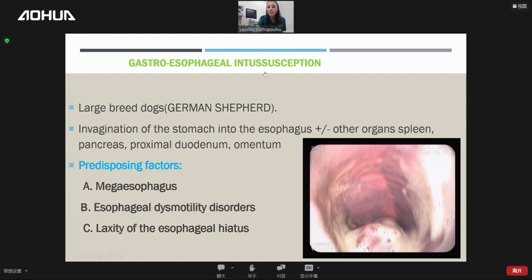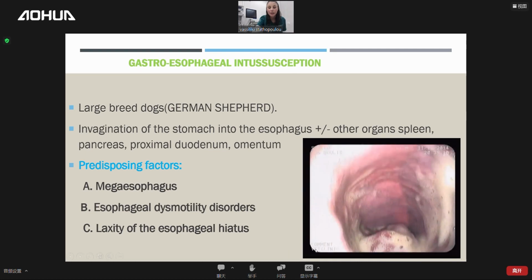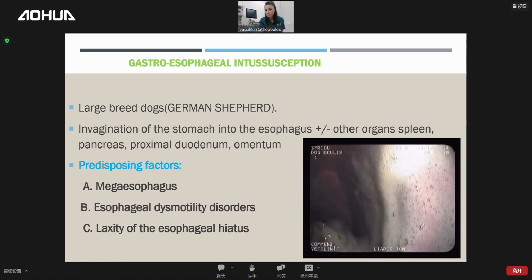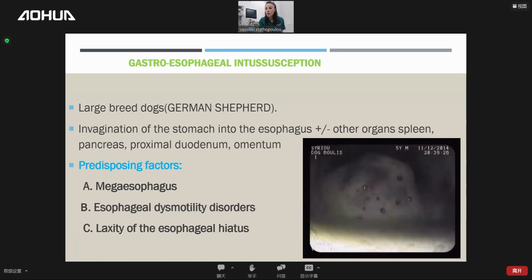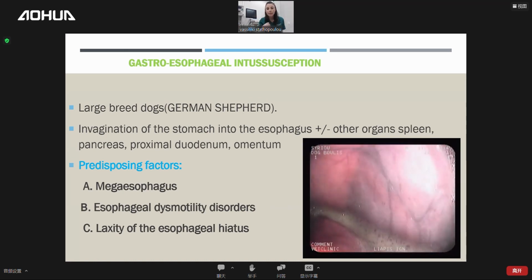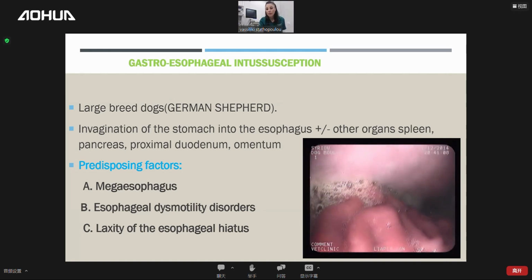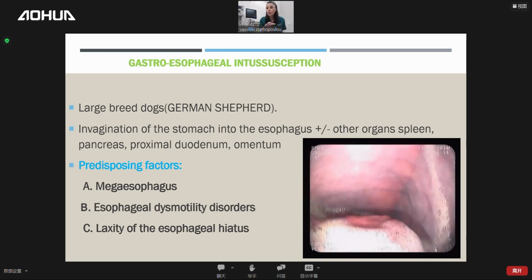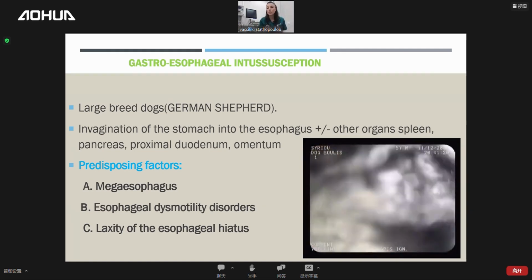gastroesophageal reflux disease. Okay, let's proceed with the endoscopy. And you will see something really, really fascinating happening. A lot of foam. So we say, okay, let's just clear the picture a bit. Let's put some water and make the picture clearer. And I'm starting to have an idea of what this might be because of the rugae that I'm seeing. So all of this is stomach in the esophageal lumen.